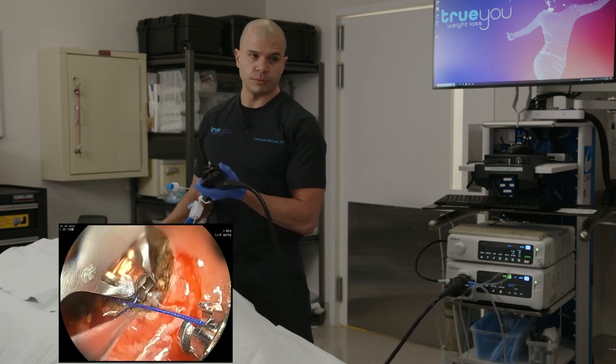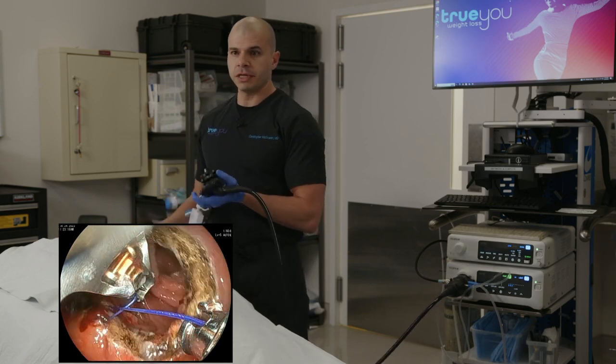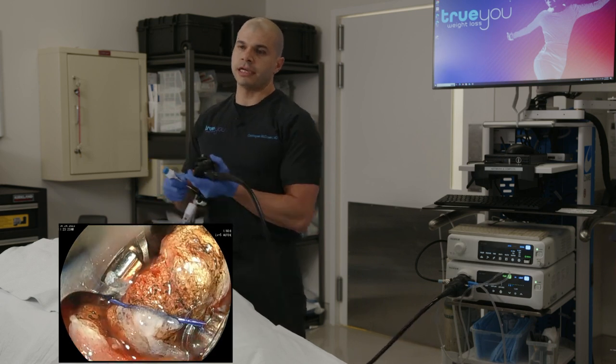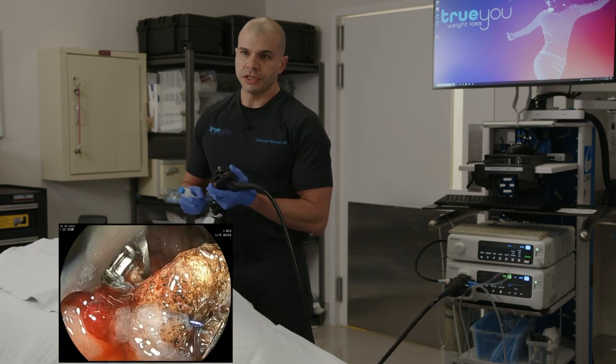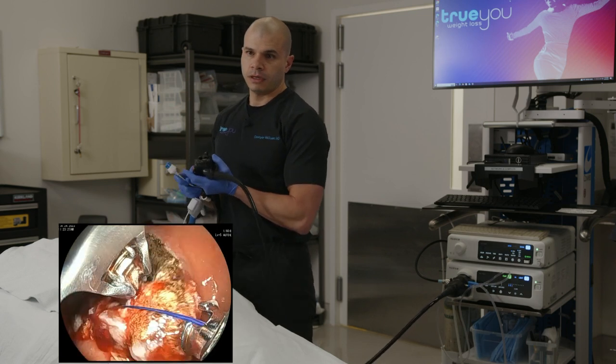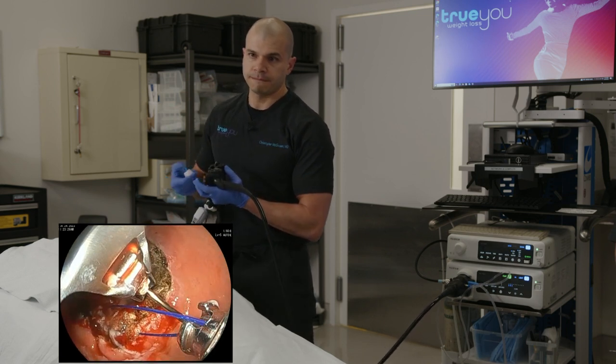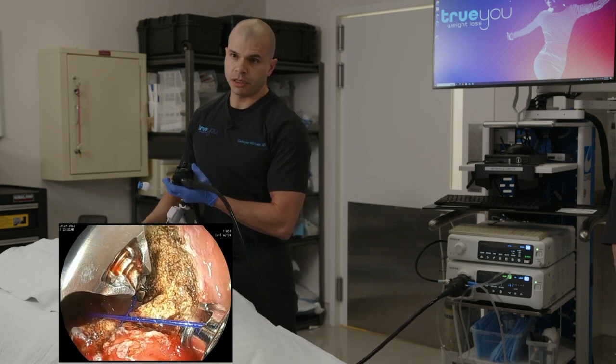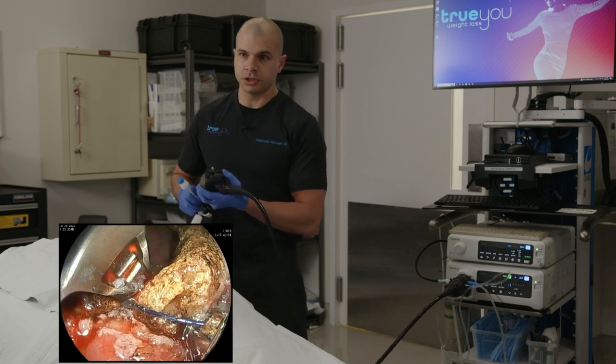I'll take maybe a couple more bites here and then answer some questions. So I'm going to space this maybe a centimeter or so apart. Again, driving needle across the anastomosis. This is a really sturdy way to suture. And this is a pretty efficient process, so I'm just going to make my way around here, just going counterclockwise, and I will take a question now.